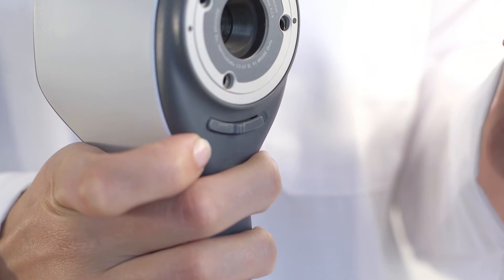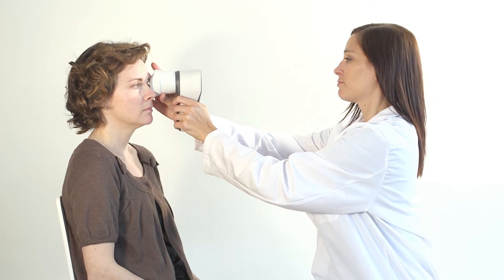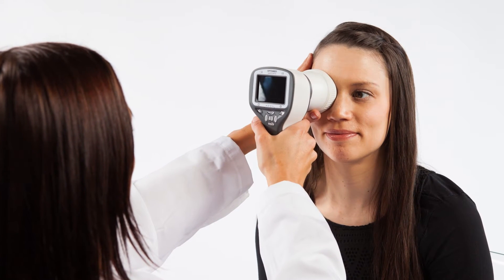To ensure the camera is stable for the image, it is recommended that both patient and examiner are seated during the examination. It is also possible to use the camera for patients lying down.